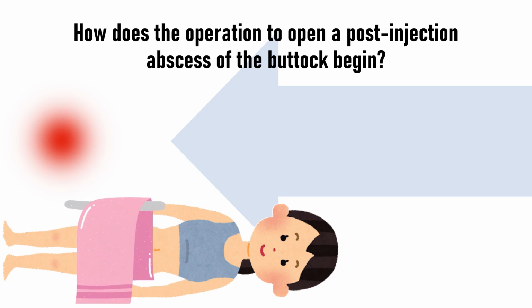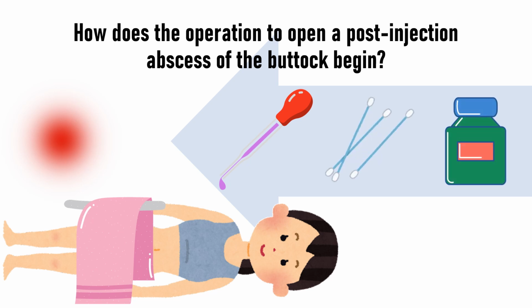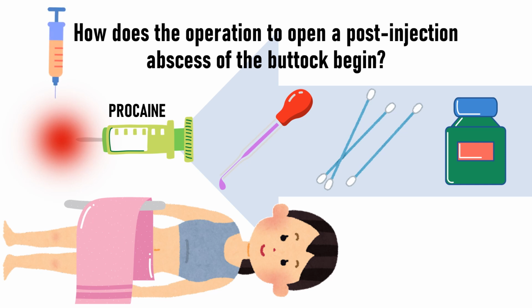Using an intradermal needle away from the hyperemia zone, they begin to inject a solution of procaine to form a lemon peel. Then take a longer needle and inject an anesthetic solution into the subcutaneous tissue and under the infiltrate. Usually, procaine solution is used. Attention, the main mistake when performing anesthesia is anesthesia of only the skin without injecting procaine under the infiltrate and on its sides.